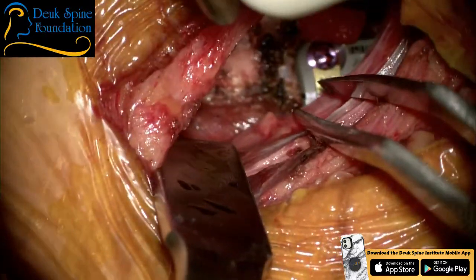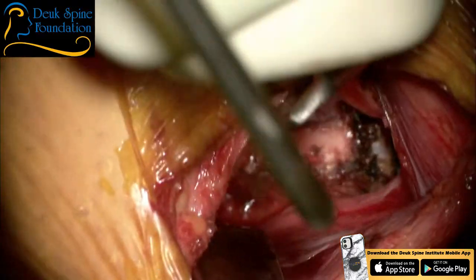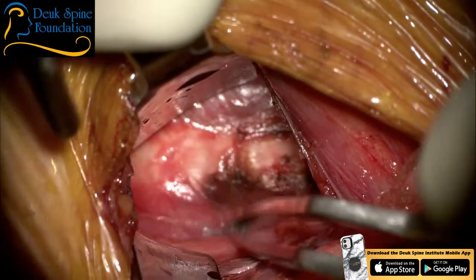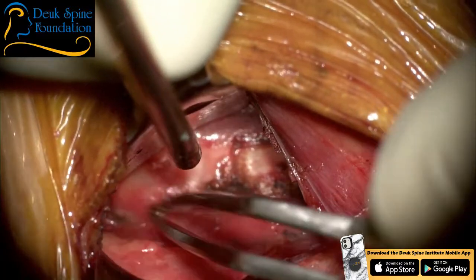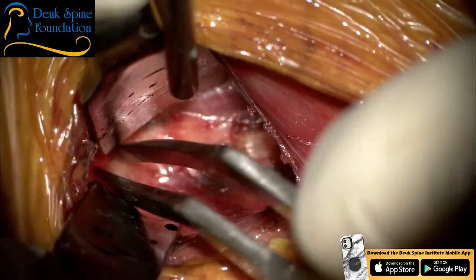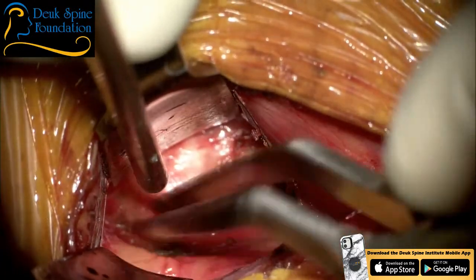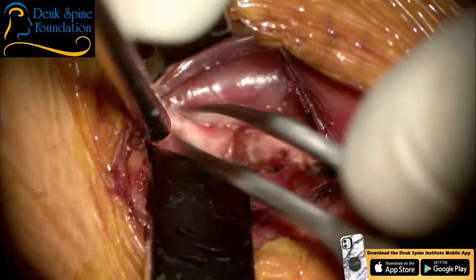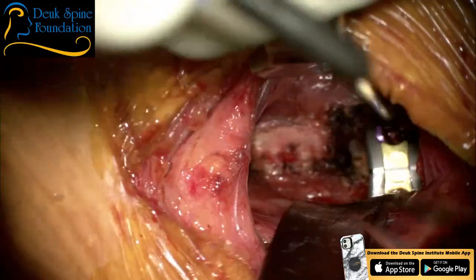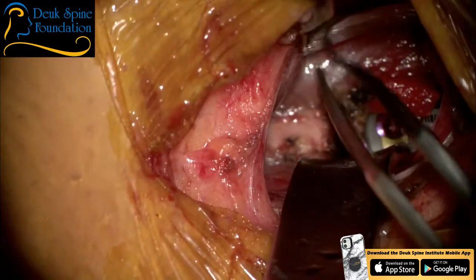Go north. I don't know where you're going. We need to go north. Watch your eyes. You got to get your knee north. There you go. I love it. Let me see up here. Yep. Nice. There's not going to be much up here because we really didn't do anything up here. But you never know. There could be a little vein somewhere just waiting to bleed. Okay, keep going south. Yep, keep going. We're on your side now. I need to see here. Yep. Beautiful.